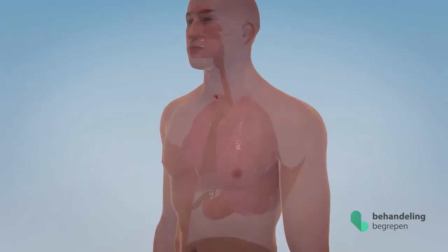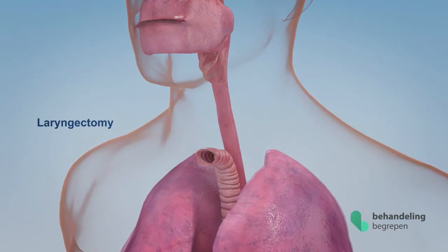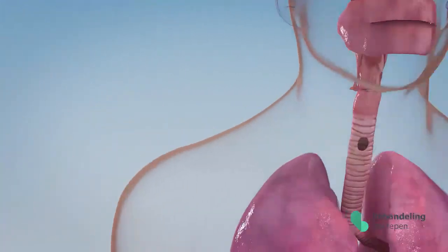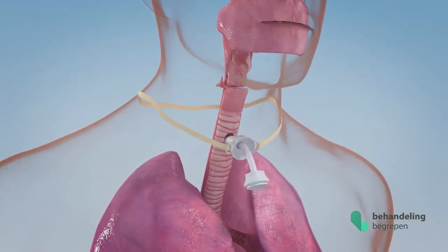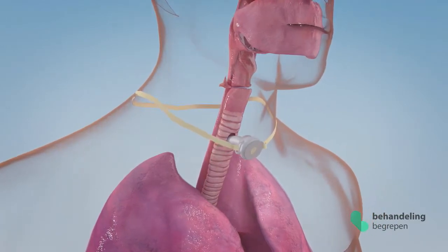This educational film is aimed specifically at laryngectomy patients with a permanent breathing stoma. For this patient group, the breathing stoma is their only airway. This method is somewhat similar to that for tracheotomy patients, but their breathing stoma is generally non-permanent. Tracheotomy patients have a cannula, often inner and outer cannula. The inner cannula may be removed, but not the outer cannula.